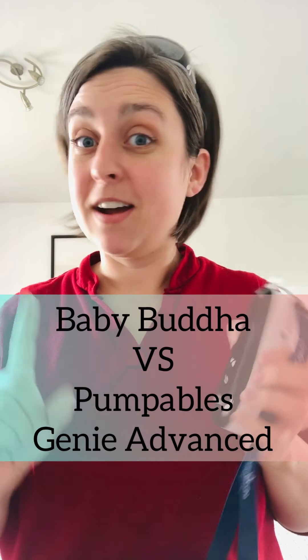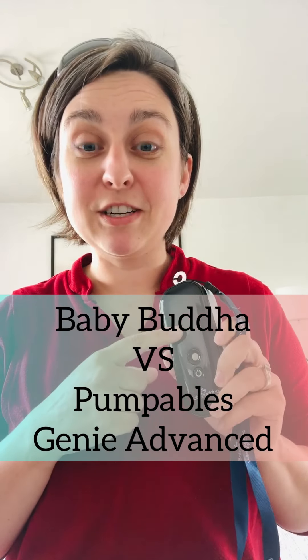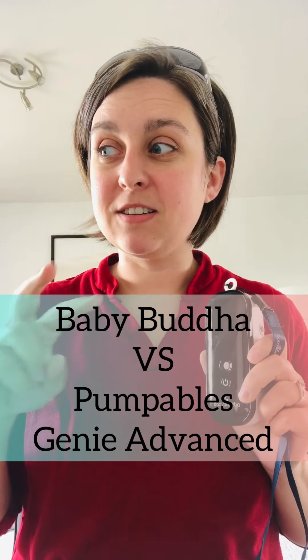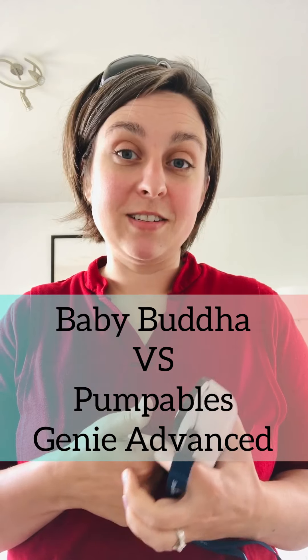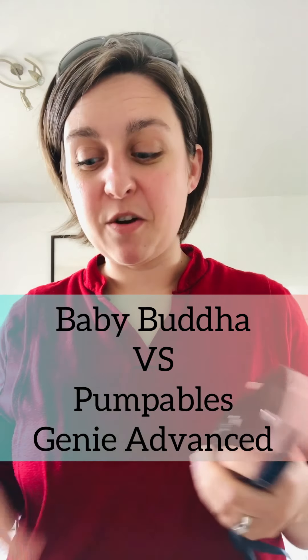I've got a couple minutes before I go get the kids from school, so I'm going to show you this Baby Buddha pump in comparison to a couple of other handheld pumps. I've had some requests on this from a Facebook group, so here we go. First, I'm going to start with the Pumpables Genie Advanced.